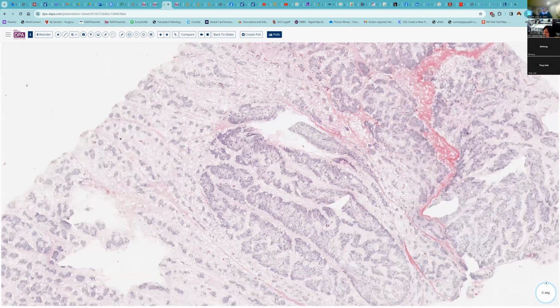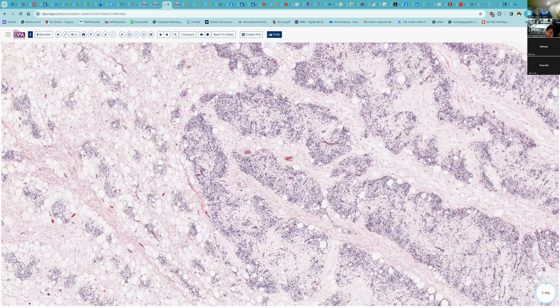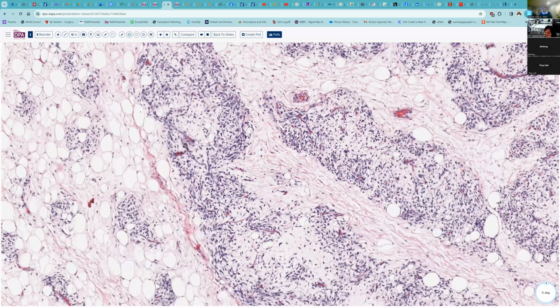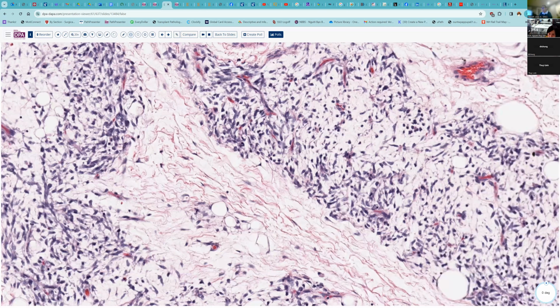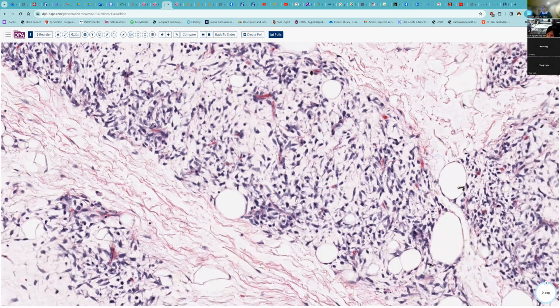This is actually a pediatric patient. And in pediatric patients, you can have an even more immature appearing mesenchyme, as you see here, this sort of organoid mesenchymal tissue. But in some of these areas here, I think you can begin to see some lipoblastic features to some of the cells. So in a pediatric or neonatal setting, one of these tumors can appear even more cellular and atypical, but can still have the same benign outcome in these patients.